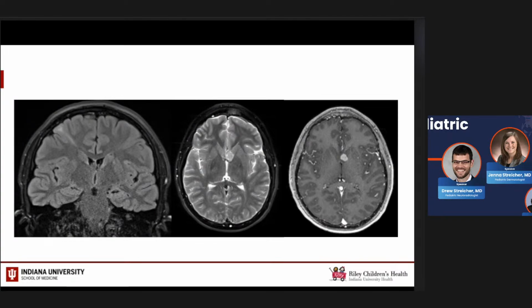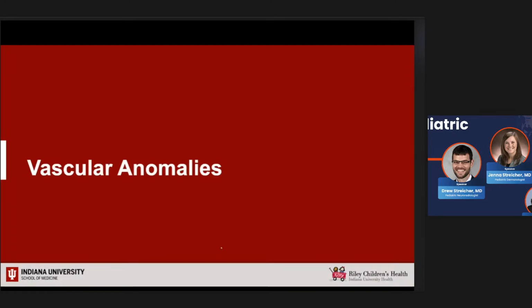And once they get large, greater than a centimeter, and start enlarging, this is when we worry about the development of the subependymal giant cell astrocytoma. A low-grade tumor, but location can be bad, and we worry about developing obstructive hydrocephalus. So that's the issue with these. They do show enhancement, so we see very avid enhancement associated with that lesion. You'll see those certainly on your rotation with us as well. Tuberous sclerosis, so a nice example of those features.